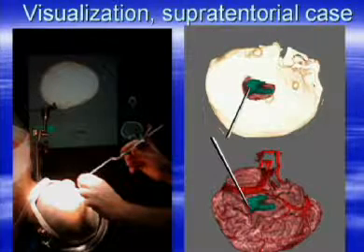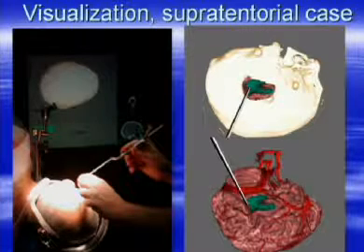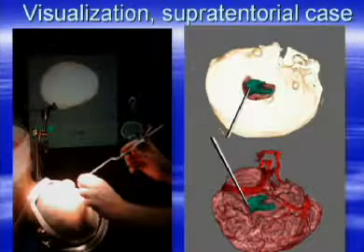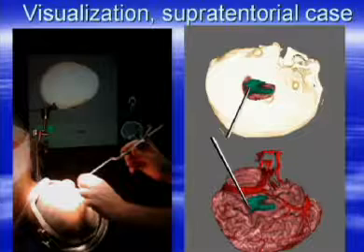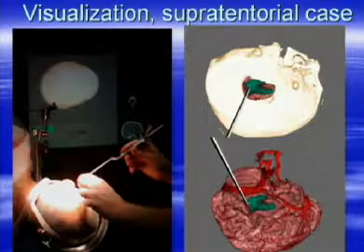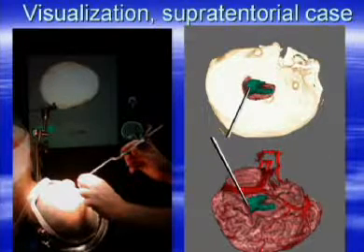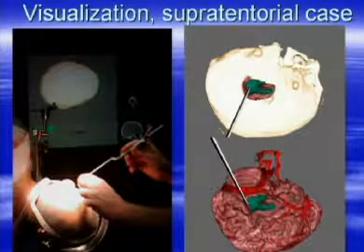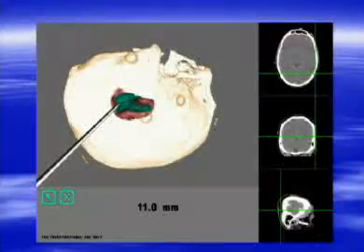This is the first case with the intraoperative MRI situation. Here we have the patient in the MRI-compatible head holder with a coil, and here we have the navigational system depicting exactly where the probe is. In this instance, we actually created a virtual craniotomy preoperatively, precisely delineating the confines of the tumor. We actually got a CT scan post-operatively, and the CT scan showing the defect post-op mimicked the virtual craniotomy we did. So in a way, reality mimicked virtual surgery that was done before the surgery was performed.